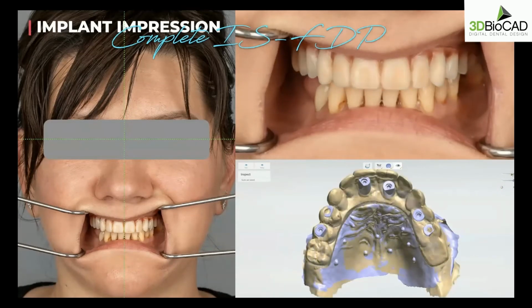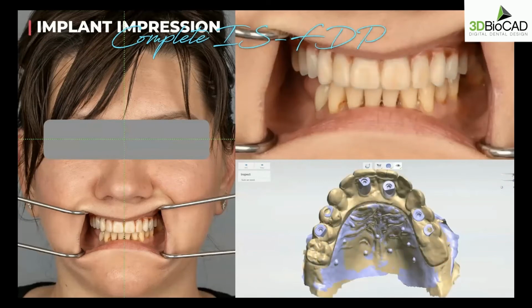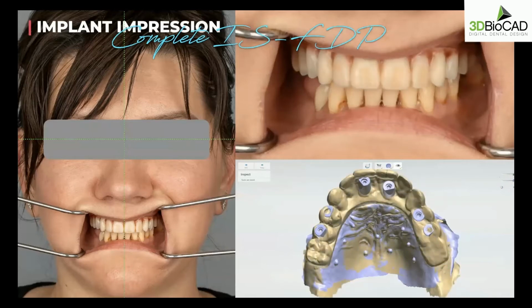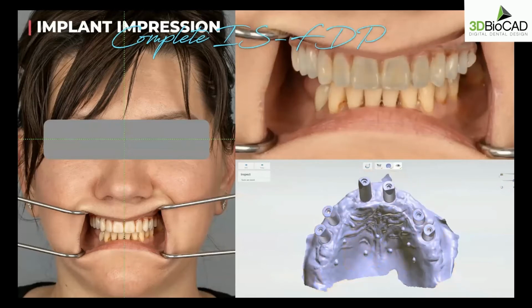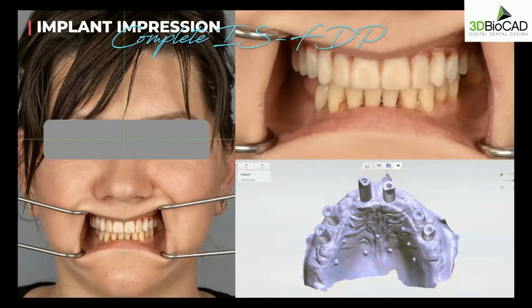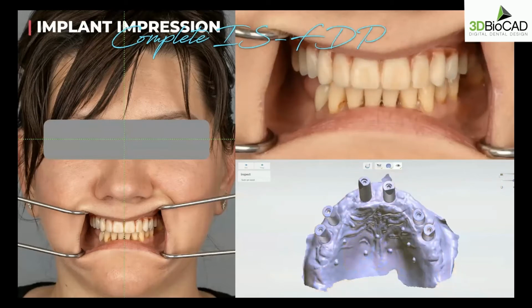And on the bottom right side, you can see that the scan body scan and the pre-prep scan are superimposed and stitched together. Now we have the scan body scan mounted on the face as well, because they're stitched together. And now we have the implant position information in the correct position inside the patient's mouth, or virtual patient mouth. So now the lab has all the information it needs to do the restoration.